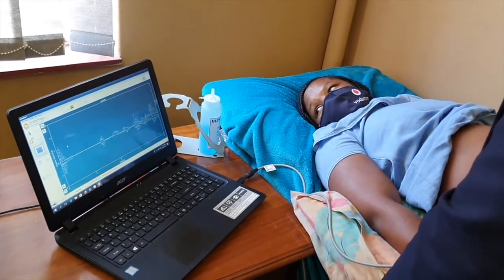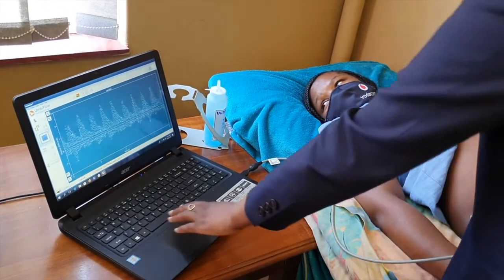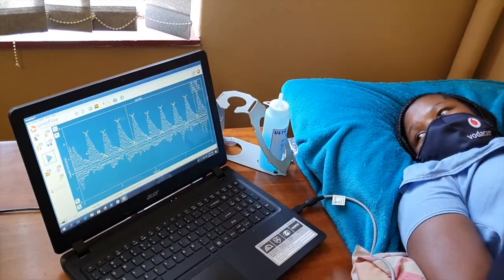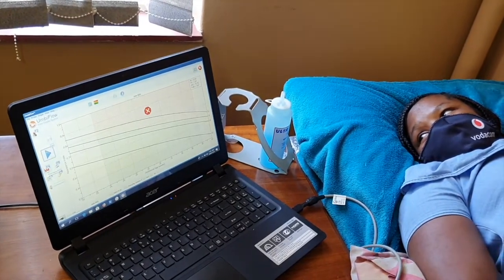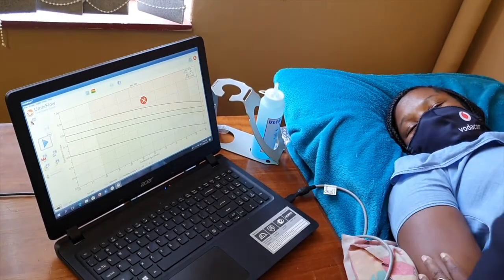The next participant is 32 weeks pregnant and is also known to our clinic with hypertension, a poor obstetric history, and high Doppler values. The RI obtained via Umbiflow in her case is 0.84 and above the 95th centile for her gestational age. On ultrasound, she was found to have intermittent absent end diastolic flow and she was admitted to the hospital for fetal observation.